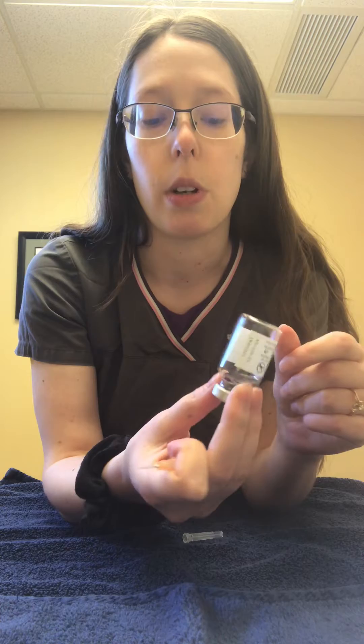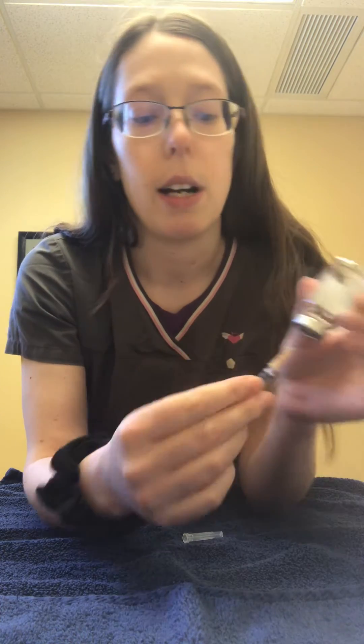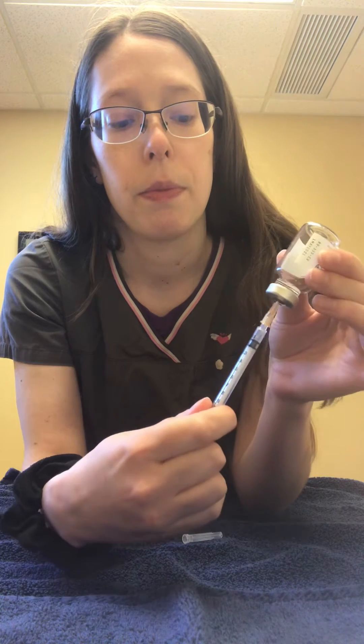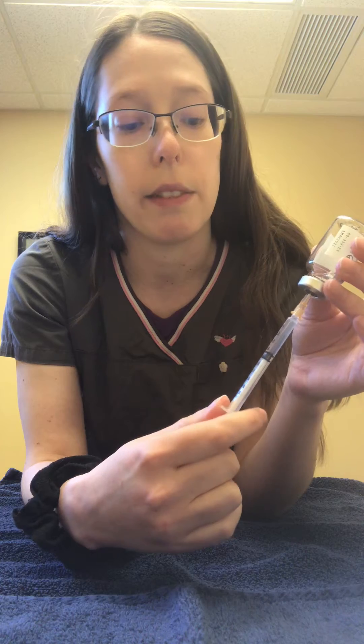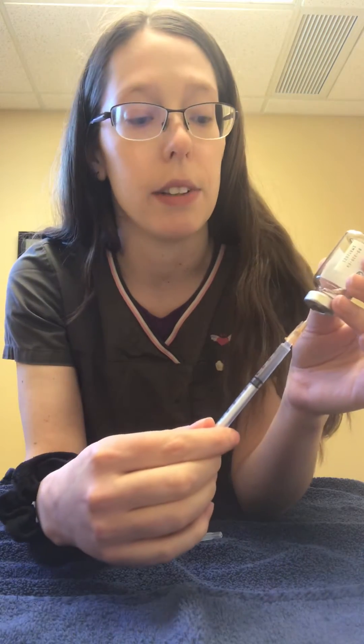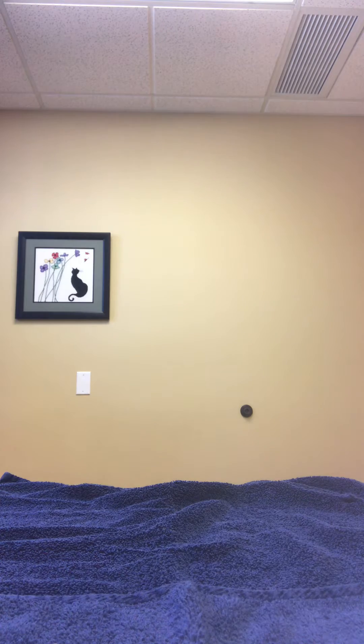So if you have a bottle at home that you're drawing from, like insulin or another medication like B12, you can go ahead and draw up your amount, however much that is. This is just saline that I'm going to give to our demo cat Raphael. I'm actually going to change this now to a new one, that way he has a nice fresh sharp needle for his injection.